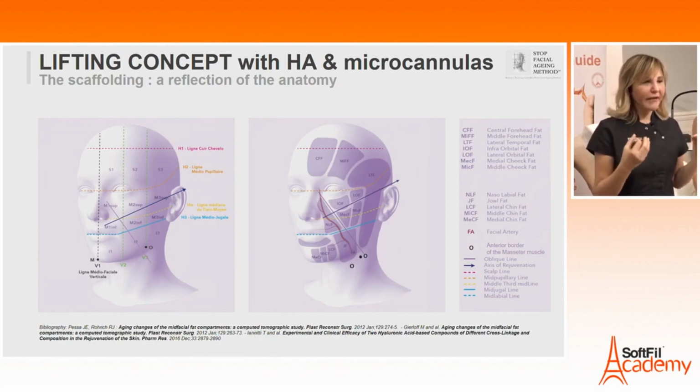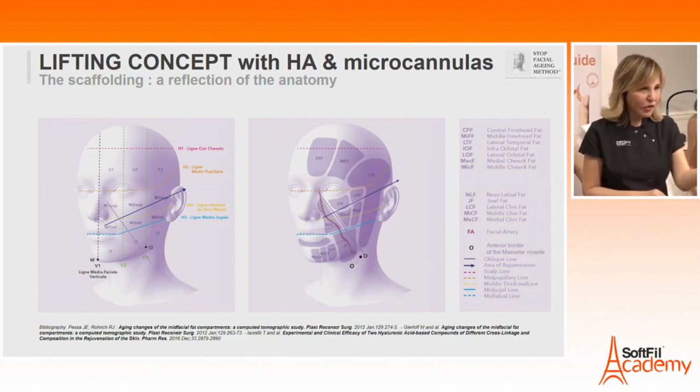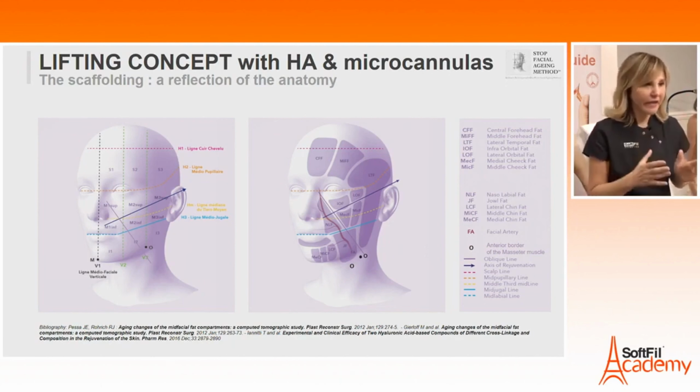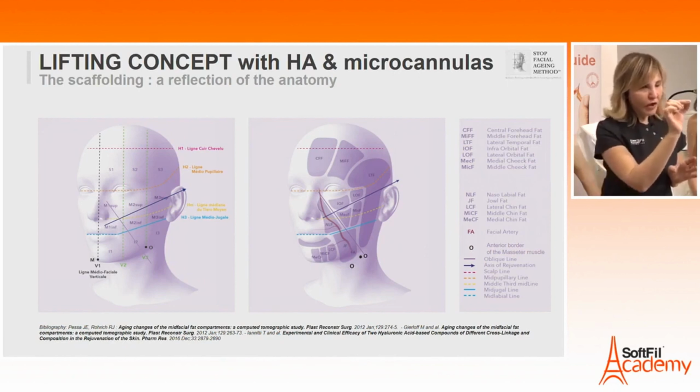Of course, you have to decide where you will inject the product on the bone, and where you will inject by the entry point. Your entry point will be located exactly on the crossing between the oblique line that you can see on the slide and a line that I have described coming from the commissure of the lips to the earlobe. This line is the center of gravity of the face. And if you want to know where to put your entry point safely and very strategically, you have to go 5 mm up from the crossing of the oblique line and this mid-face line, the two lines that you can see on the slide.